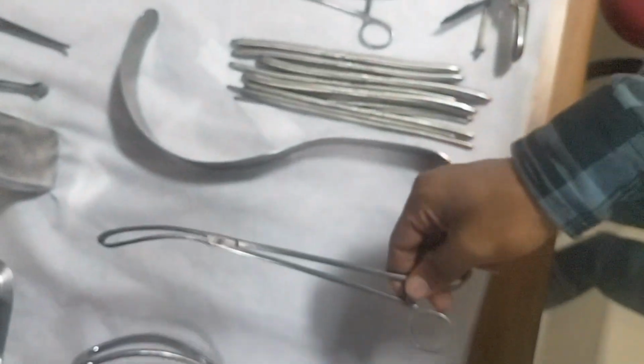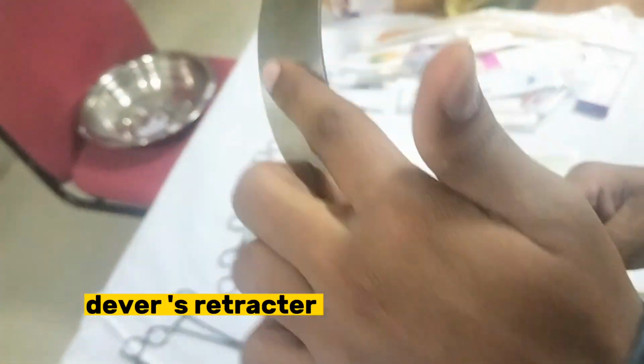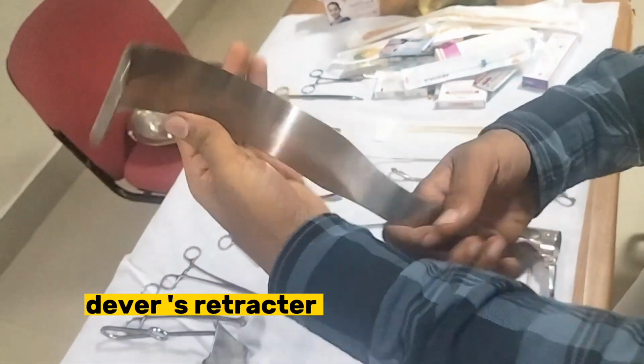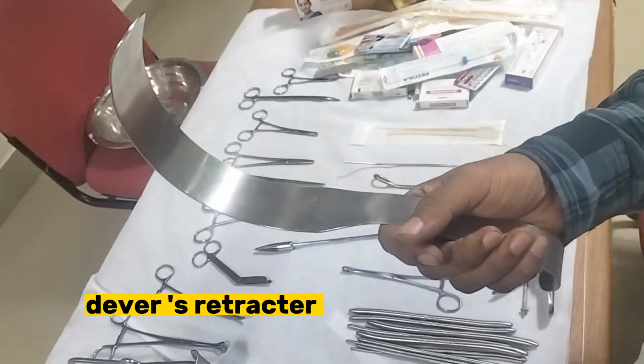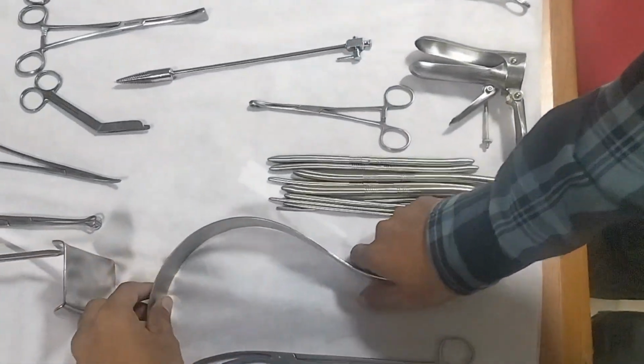Okay, this is a multiple tooth vulsellum. Here you can see this is a curved thing, joint, blade, finger ring, and 3 ratchets. Here we got Deaver's retractor with curved blade and long shaft and holding like this, and used for obstetric cesarean sections, laparotomy, abdominal hysterectomy. Okay, and in surgery it is used to retract the liver.